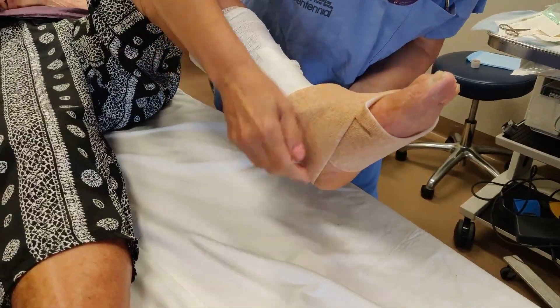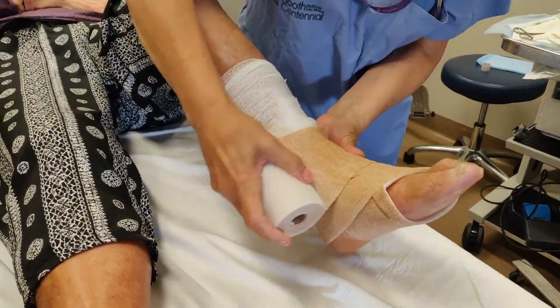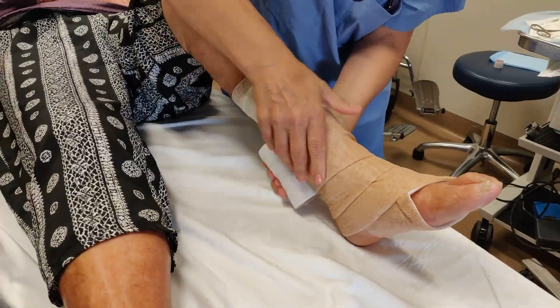First, a cling, then two layers of compression. As they are wrapped, the doctor ensures that there is stiff compression to treat the underlying issue.